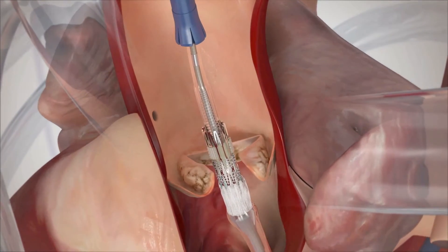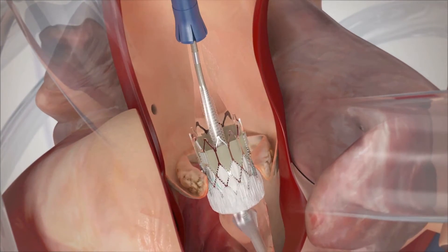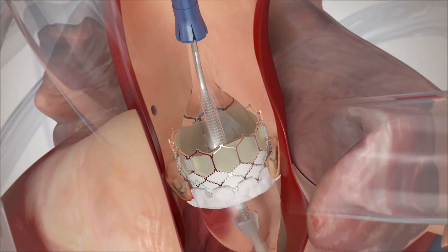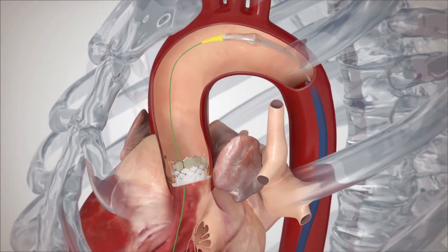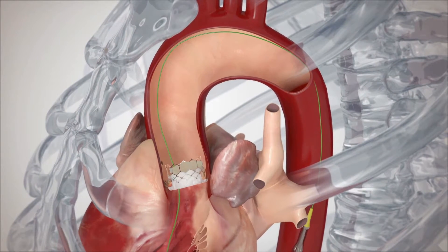When the correct position is achieved, the heart is rapidly paced to reduce movement and the deployment balloon is inflated. This expands the new valve's metal stent frame, pushing the native valve leaflets aside.